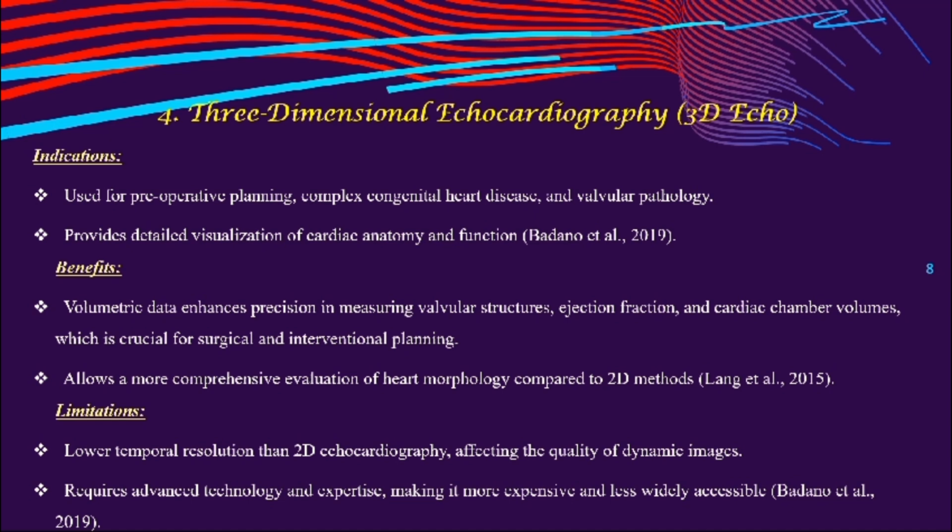Benefits. Volumetric data enhances precision in measuring valvular structures, ejection fraction, and cardiac chamber volumes, which is crucial for surgical and interventional planning. Allows a more comprehensive evaluation of heart morphology compared to 2D methods.